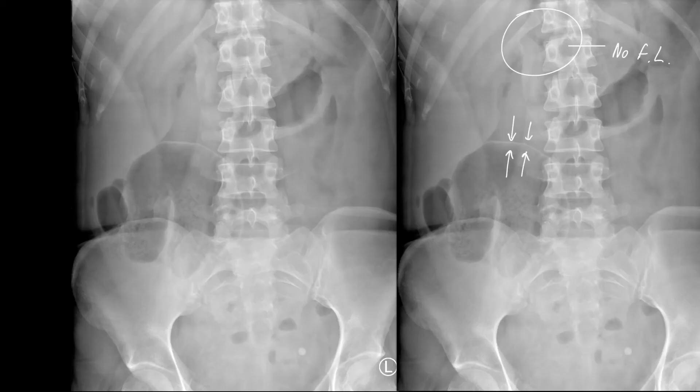In an adult, this patient has got a Rigler sign denoting pneumoperitoneum, but there's no falciform ligament sign because the falciform ligament is oblique to the incident beam.